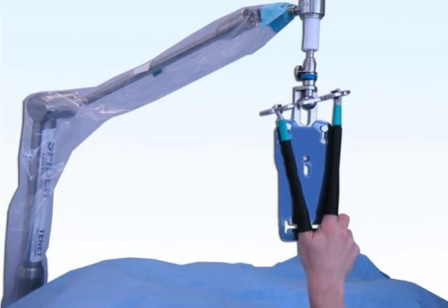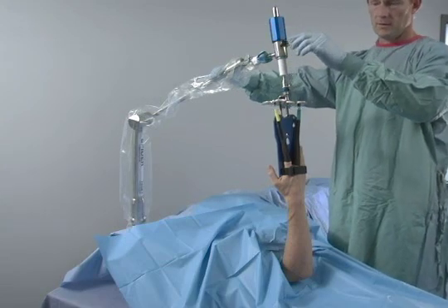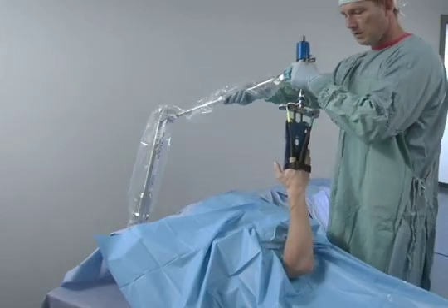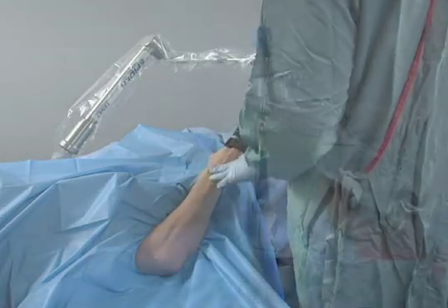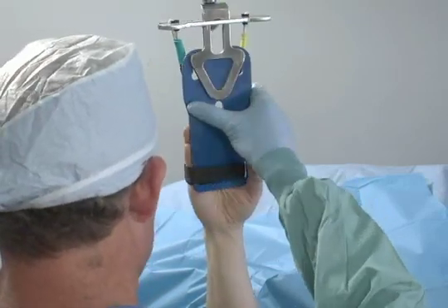Tenet recommends the use of two finger traps for any wrist procedures. The thumb and index fingers should be used if the operative procedure is on the thumb or if ulnar deviation is required. Alternatively, the index and middle fingers could be used depending on surgeon's preference. The position of the arm is not required to remain vertical — the forearm can be positioned at almost any orientation and angle to the table and then locked in place. As long as there is traction on the arm, the wrist will be in a rigid position. Surgeon's preference or required orientation will guide the choice of these alternative positions.